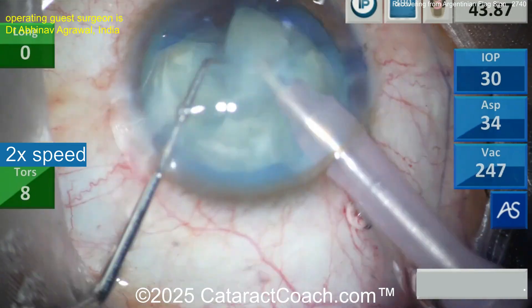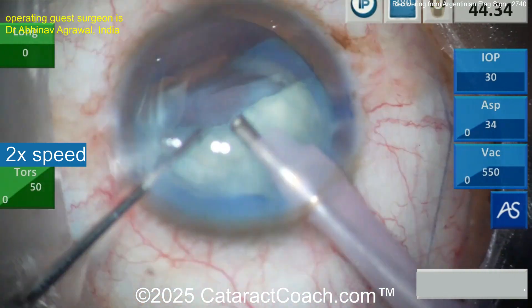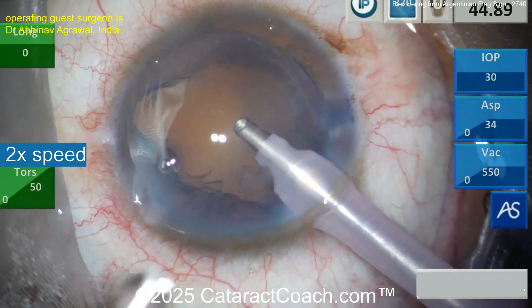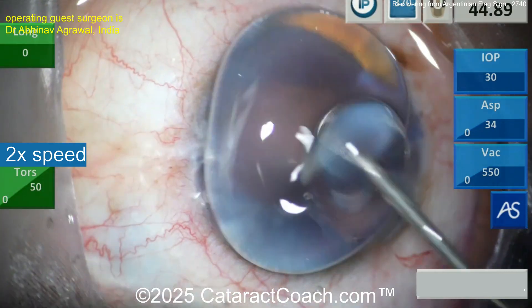But remember with the can opener techniques, the patient did fine. Why? Because if you have 20 different points of capsular runout, you don't put a ton of pressure on any one spot. Instead, what you do is distribute it evenly among all the runout areas, and it tends not to run out then. That's the magic of it.